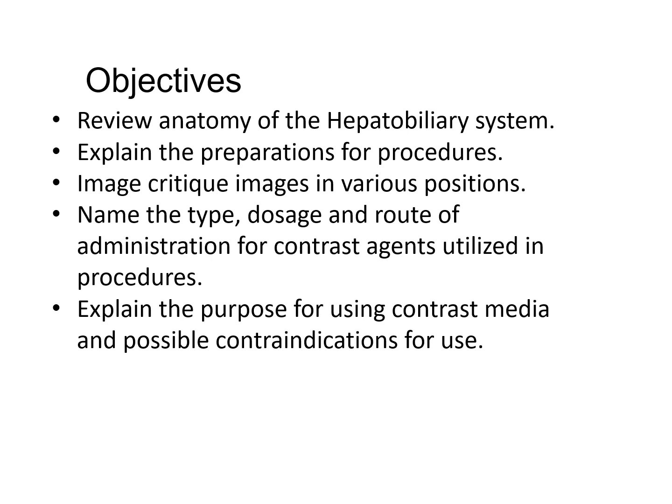Image critique, images in various positions. There are some key positions that I'm going to talk about for the gallbladder. The best positions for the gallbladder are just the straight AP, and then the RPO is another good position for the gallbladder and the biliary system, and I'll talk about why you would use those.